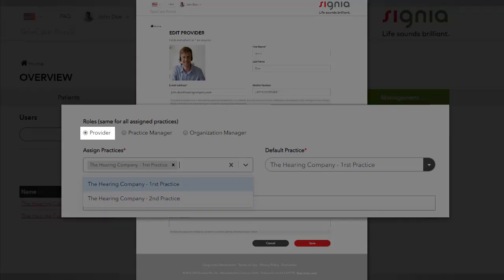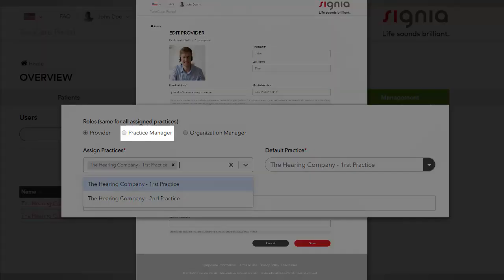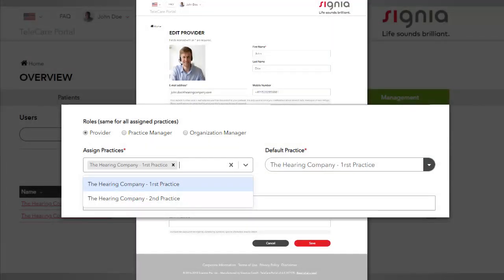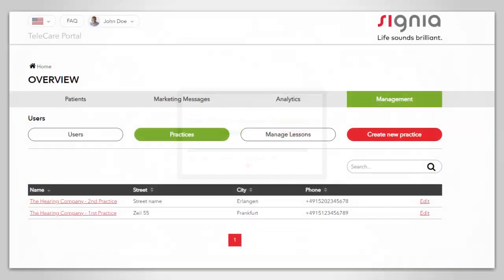The first role is Provider, which is the default role, and the second is Practice Manager. All users under the same practice have access to the data of all clients under this practice. The practice managers have additional organizational rights.